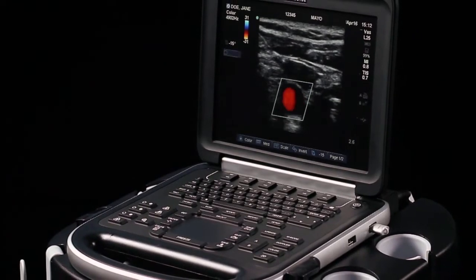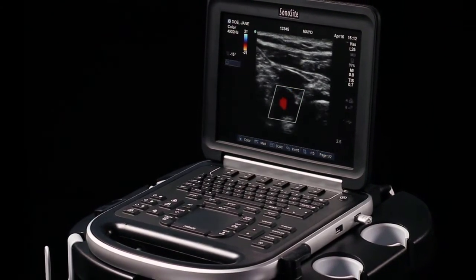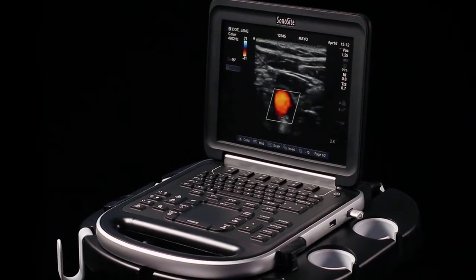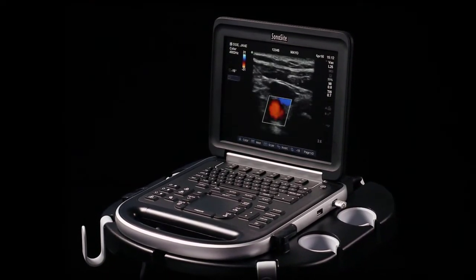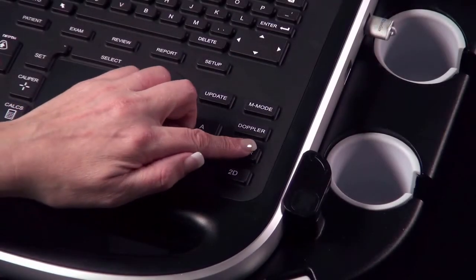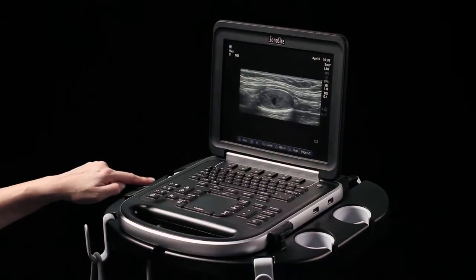The SonoSite Edge offers superb image quality and increased speed, along with SonoSite's traditional reliability in a laptop-sized unit. This short video will demonstrate the key features and functions of the SonoSite Edge system.